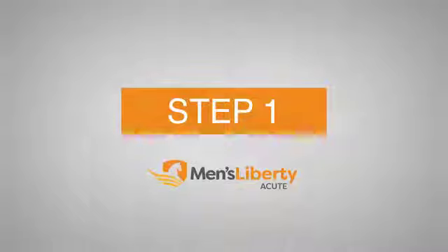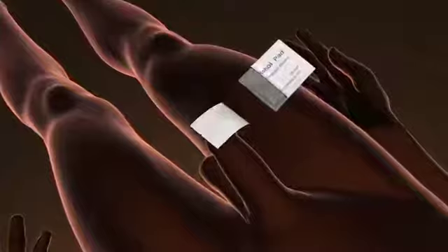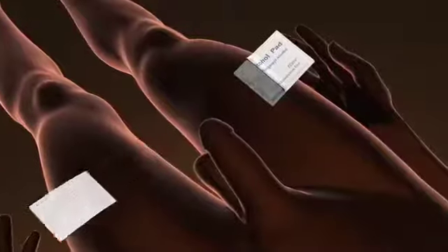Step 1. To begin, wipe the head of the penis with the alcohol wipe and allow to dry completely. The alcohol must be completely dry before the next step.